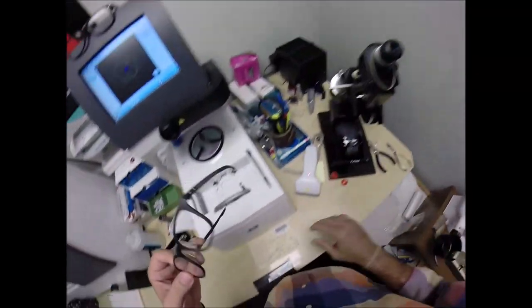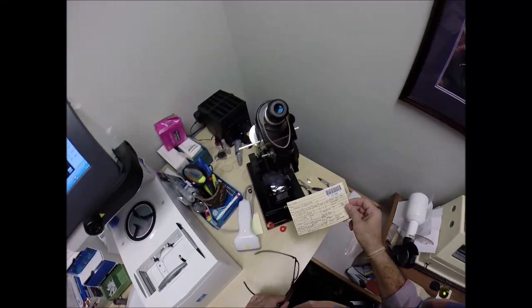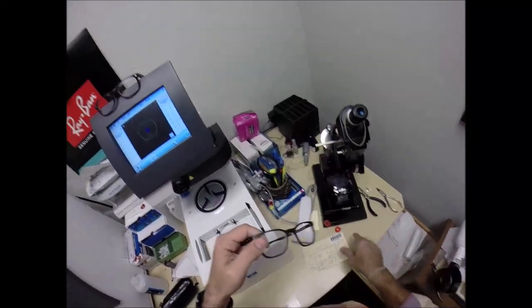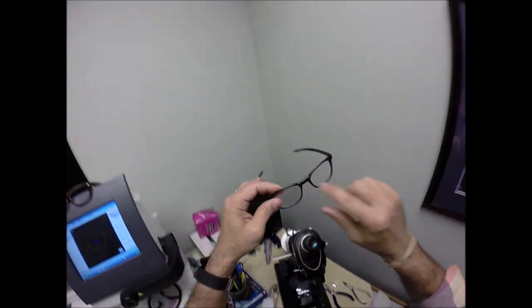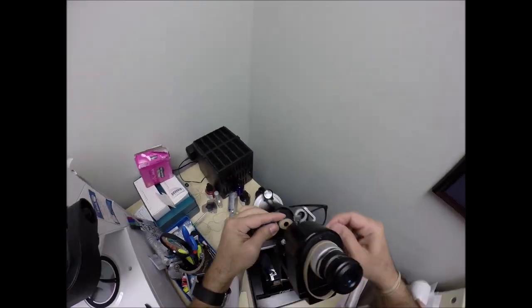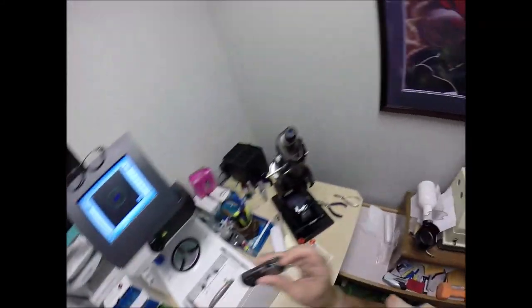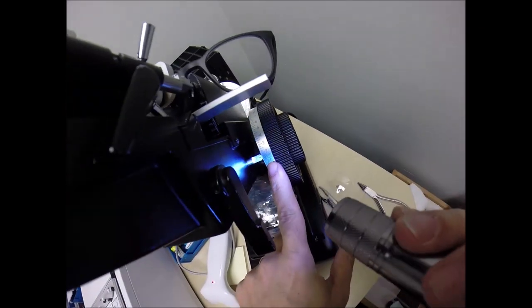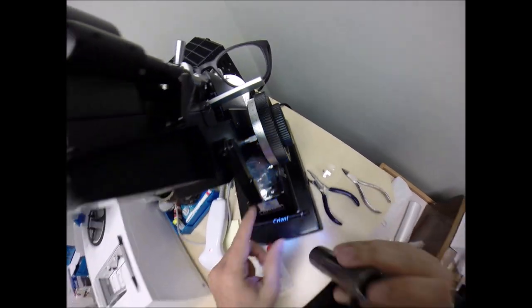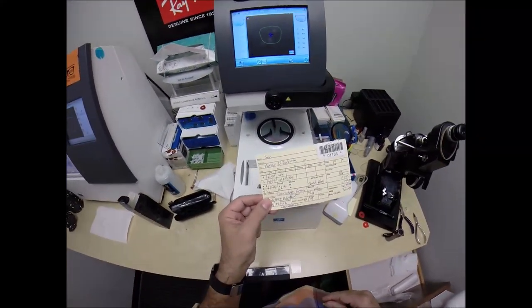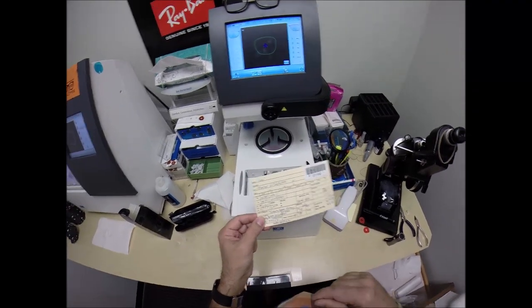So we're going to come down here to the lensometer. We're going to spin the axis wheel to nothing because your right lens is spherical, plus 150 sphere. So I'm going to place it in above that black dot and read the power. And I am getting plus 150 exactly halfway between 1 and 2.